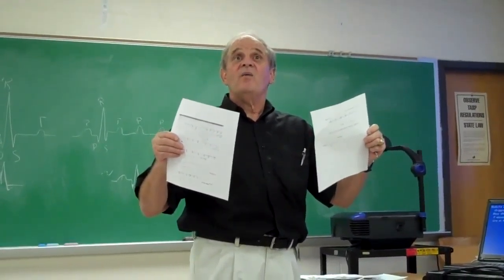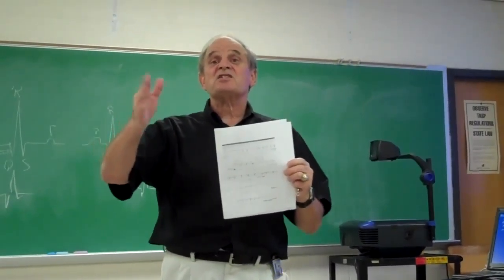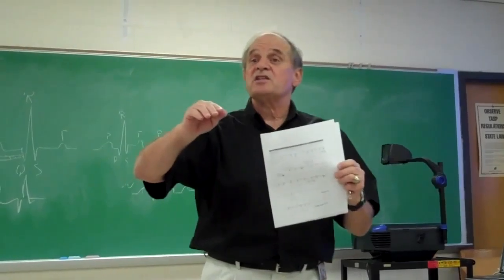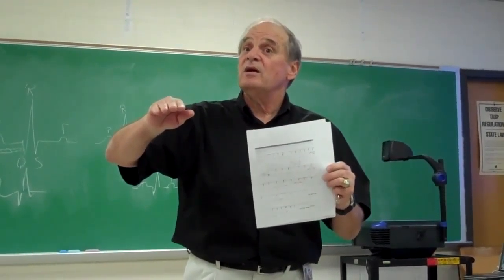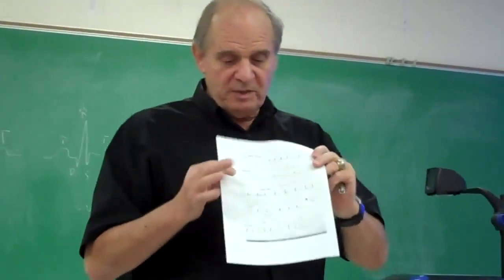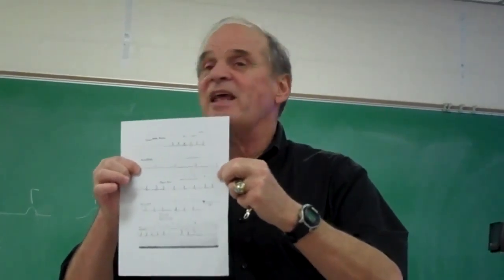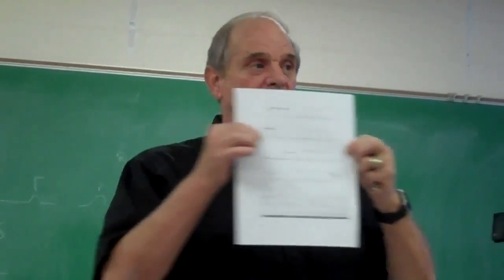What do you want to say? Okay, let's simulate sinus rhythm. Let's make the machine do sinus bradycardia. This one right here, I've had them turned upside down, would be kind of like Lance Armstrong. That's sinus bradycardia, an abnormally slow heart rate.